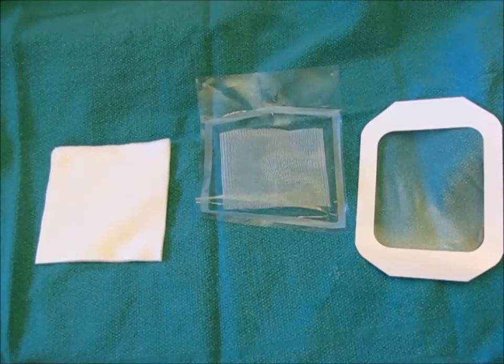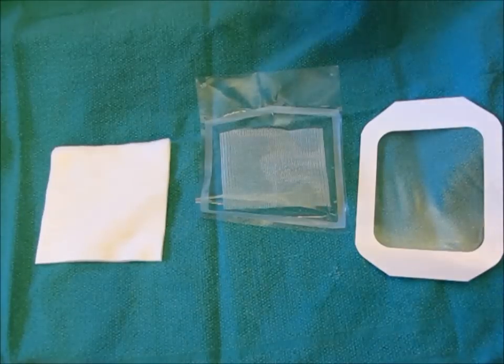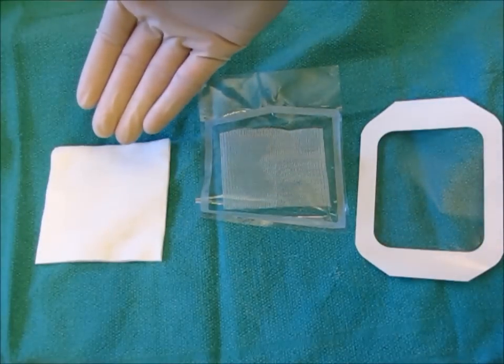Before removing the chest tube, you must create an occlusive dressing. An occlusive dressing is used to prevent re-entry of air back into the pleural space. You require a large Tegaderm, Vaseline gauze, and some 4x4 regular gauze.